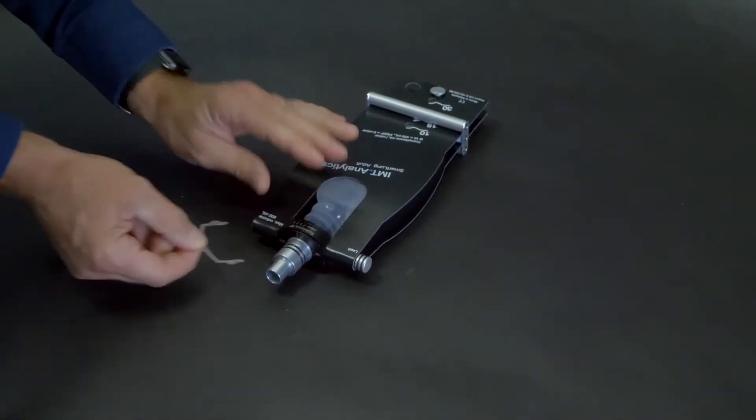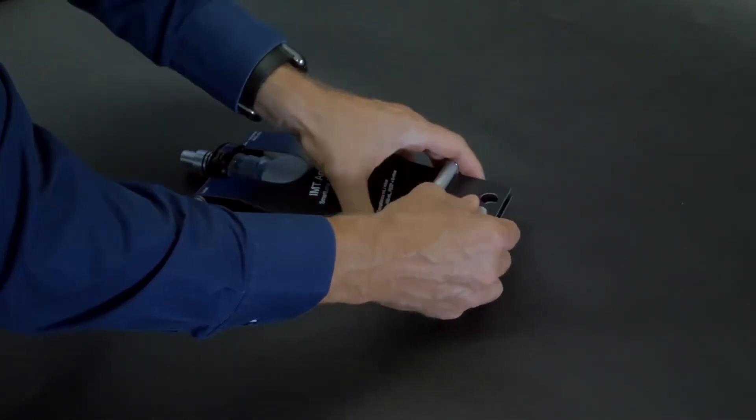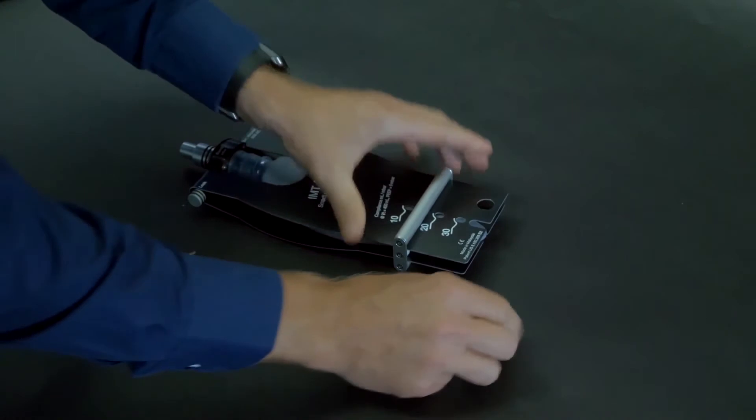Remove the retainer clip and push the resistance head downwards between the fiber plates. Pull the silicone bag out through the bottom to access and remove the pin.